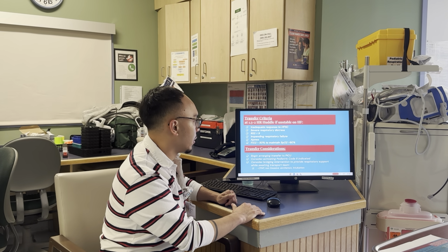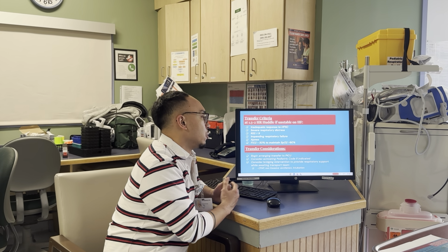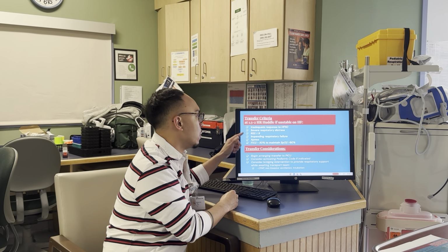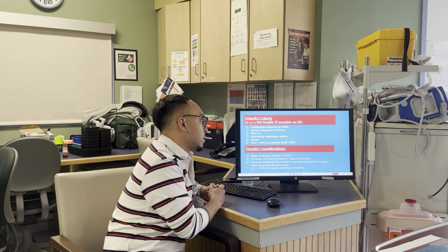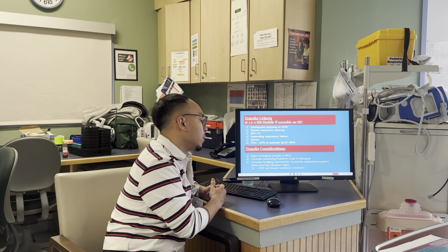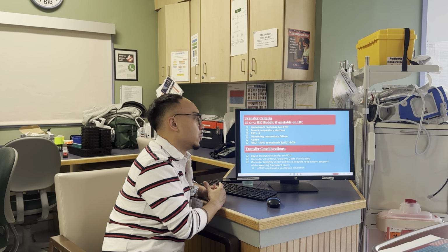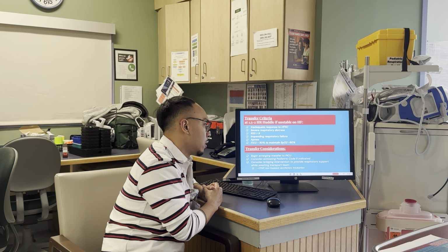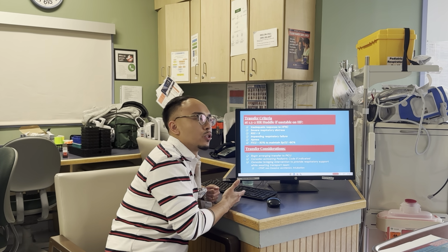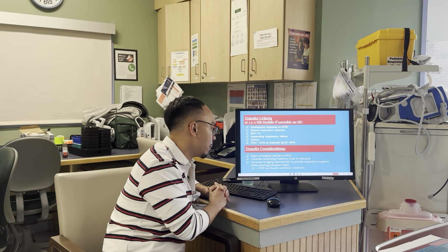So transfer criteria at the 1.5 to 2 hour huddle, if unstable on high flow. So the reasons why we would transfer them out is inadequate response to the high flow. They have severe respiratory distress. Now their RSS is 9 or greater. They have impending respiratory failure. They're apneic or FiO2 needs are greater than 50%. And then some considerations when you do transfer. One, of course, you're going to call the transfer center, which is either Hackensack or Robert Wood, whatever you need at that time.